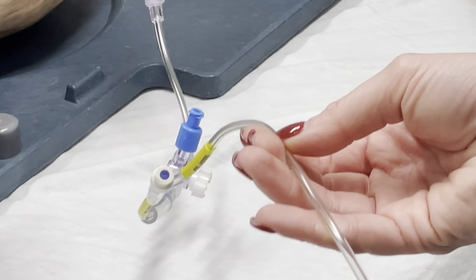So if you come to the back of the drain here, you will see that there is a little hole down here. This is where your level is going to go. I'm just going to push it in. And then you'll notice that it is right where the transducer is. So that's how you know you're going to be level. For your patient, you are going to level to their tragus, which is the inner crook of their ear here. You can do this one of two ways. You can raise your drain up and down, or you can raise your stretcher up and down. So we'll eyeball it and see where we go.